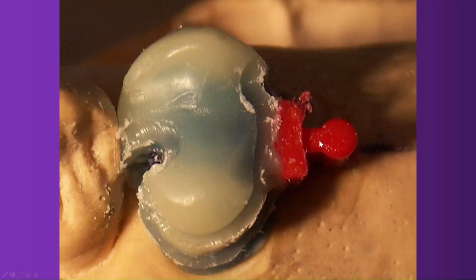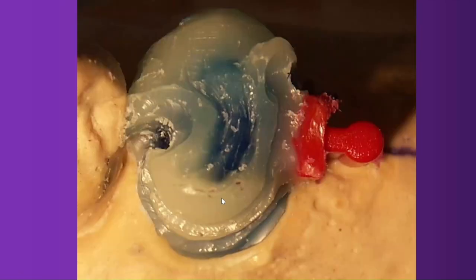This tooth, of course, would have to be more refinished to create space for the ceramic, but the ceramic had to be at a distance from the mobile element, so we needed to do another small wall against which the ceramic would stop. So that's how we were doing it. It's incredible complication at that time, but that's how we were doing. That's why we were working 2005, 6, 7, 2010. And just there, you see in the middle, we would be able to place the ceramic after we cast this system.